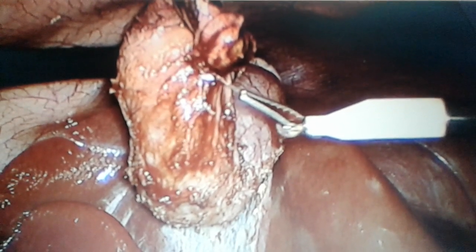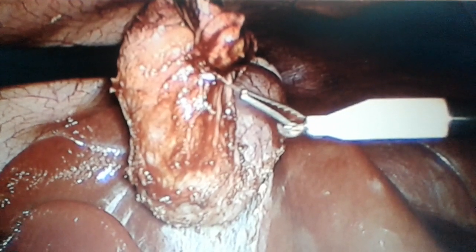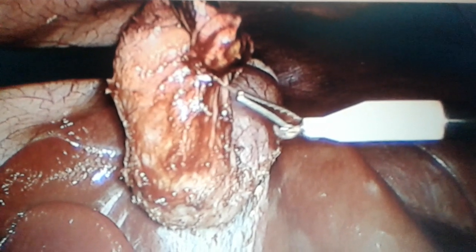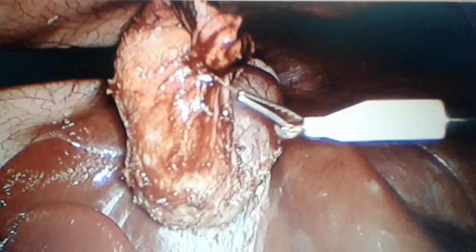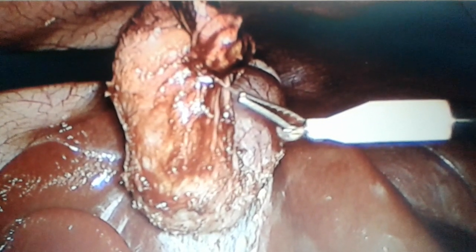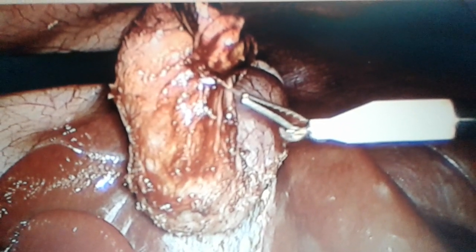Think about it. Analyze the situation. Use your analytical mind. If suppose you are operating this patient, or even if you are not operating, you are a member of the team who is operating this patient, what will be the suggestion given by you? Write it down in the chat box. What to do at this level.